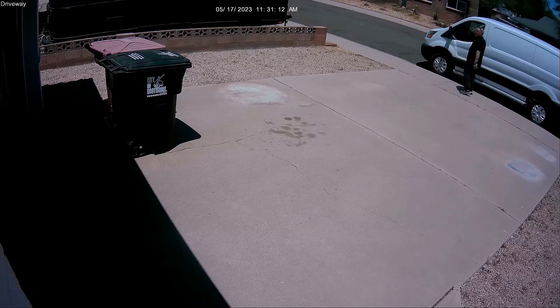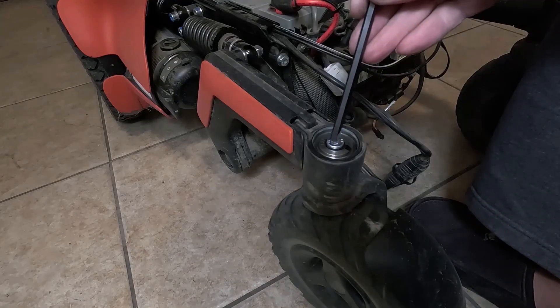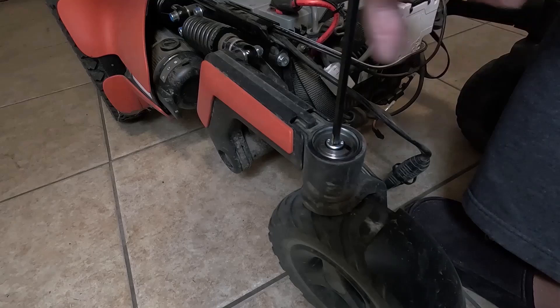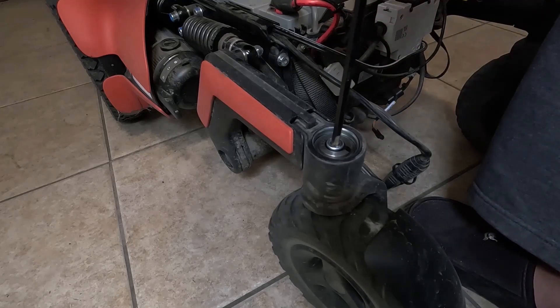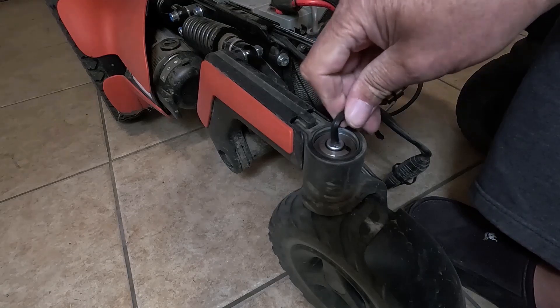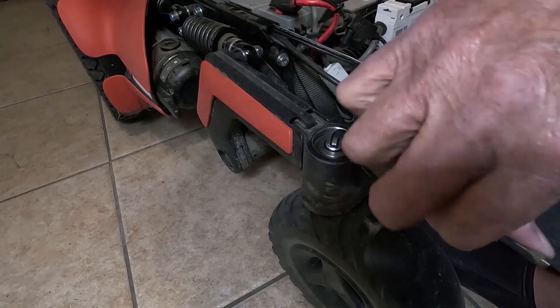I decided to check out the left caster myself. The bolt was loose — it took several turns to tighten it. This bolt holds the caster fork in place and puts tension on the flutter brake. The extreme caster flutter never happened again after tightening this bolt.